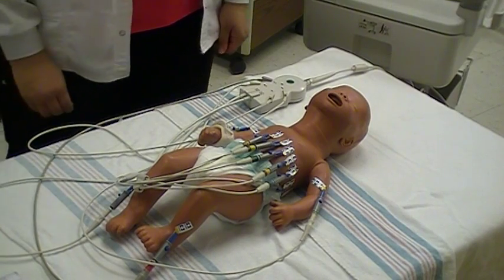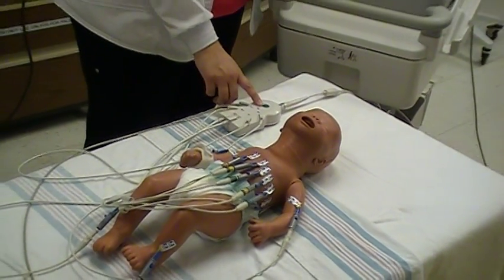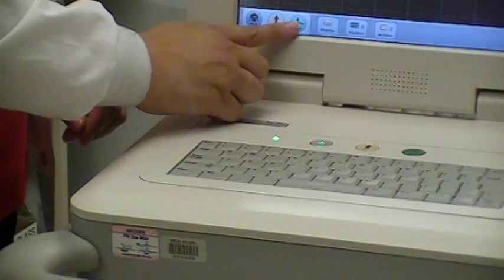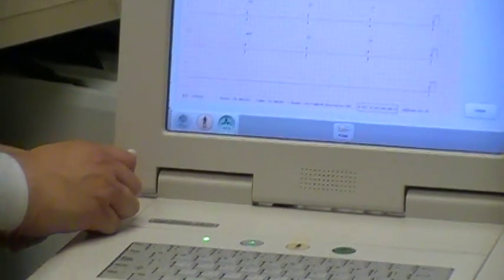To acquire the 12-lead EKG tracing, you can press the green dot on the 12-lead EKG arm, on the machine itself, or on the EKG screen. That acquires the EKG lead tracing.